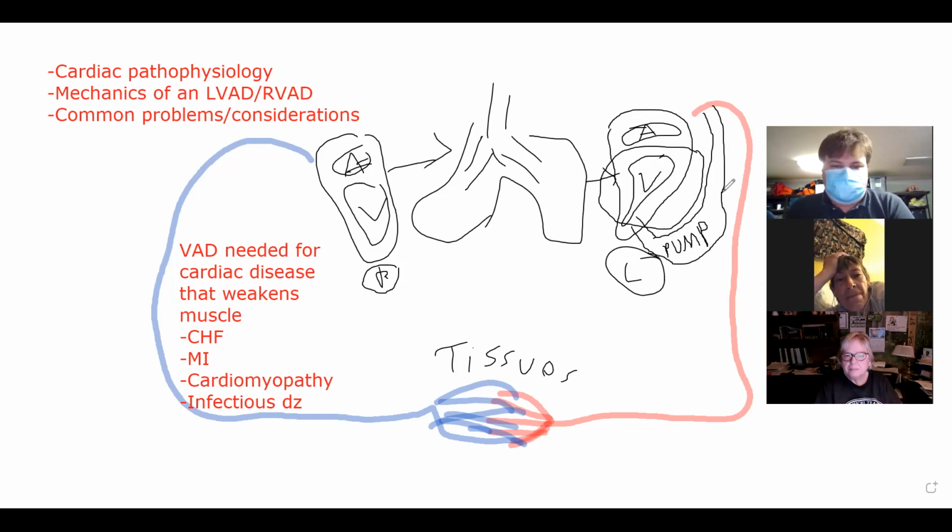It is meant to be the pumping power of the ventricle. So it's a ventricular assist device. It does a lot of work to take the work off of the ventricle. Sometimes it does most of the work. Sometimes it's just supportive work. And it's usually reserved for people who have failed some sort of medical management, such as medications, lifestyle changes, and other things. Based on the place that we're putting this inside the body, it is not an easily serviceable device, which makes it a little more of a high acuity thing.